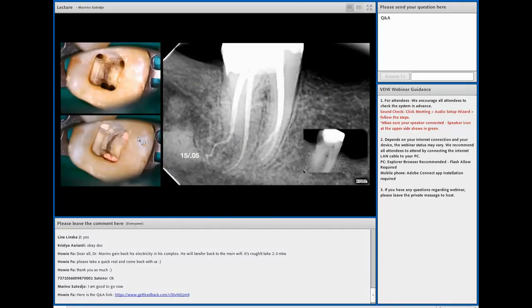So for example, this is a case that I worked on at the time with the M2, because at the time there was still no rotary. In this typical distal canal, I could stop only at 1505. But I can make a larger taper at the coronal. Even if I use 1505, if I put in my little brushing, I will not create 1505. Maybe I create at the time 6% taper, not 5% taper, because I introduce brushing motions to create more coronal enlargement. And why do I need to do that? Because I want to make it a funnel or taper enough so my irrigants can go into the root canal and have a better flow into the length and clean the systems.